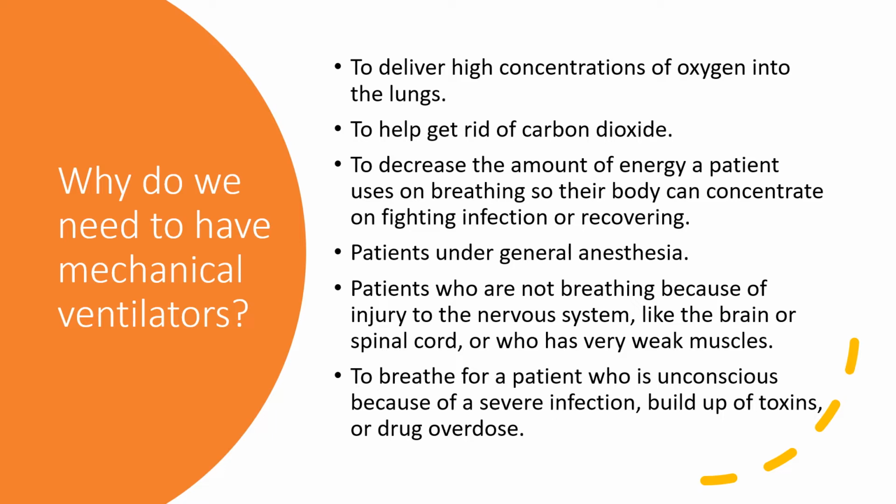If you intubate somebody, you could deliver variable FiO2s to the lung, meaning different concentrations of oxygen. And at the same time, you could utilize PEEP, which we're going to get into a little bit more.